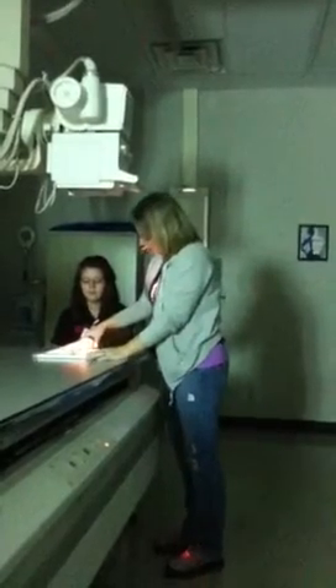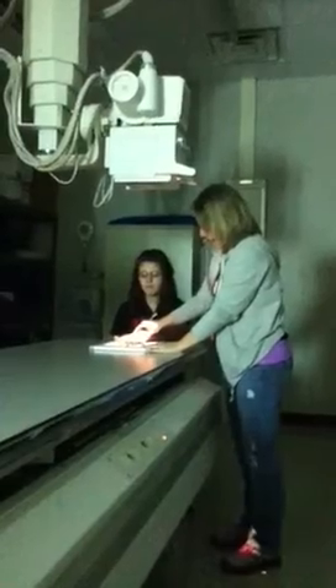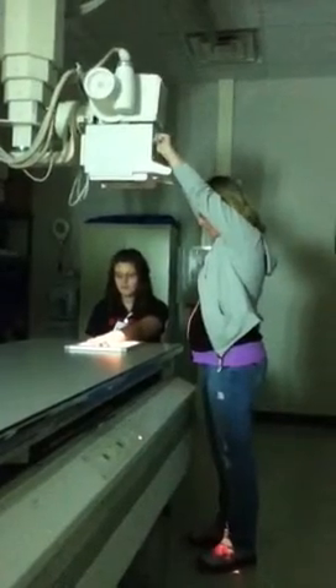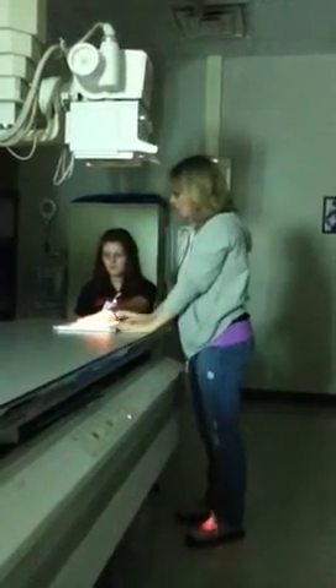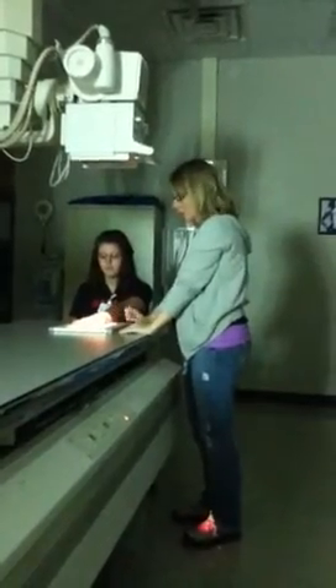You'll align their hand so it's in the middle of the cassette. Then you'll collimate down to include all digits and approximately one-third of the distal radius and ulna.